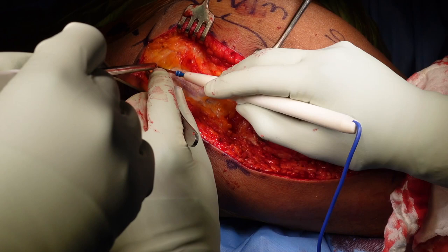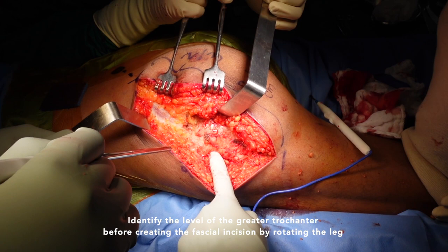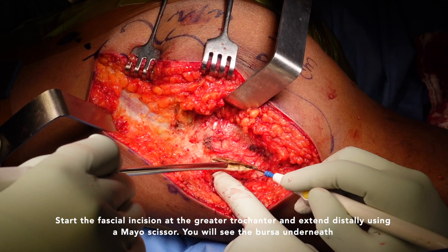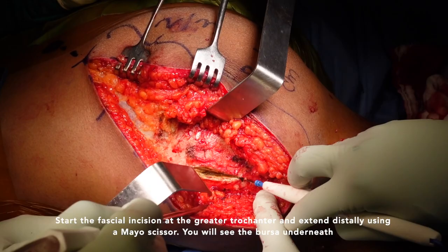Identify the level of the greater trochanter before creating the fascial incision by rotating the leg. Start the fascial incision at the greater trochanter and extend distally using a Mayo scissor. You will see the bursa underneath. Cut the fascia of the gluteus maximus using scissors.